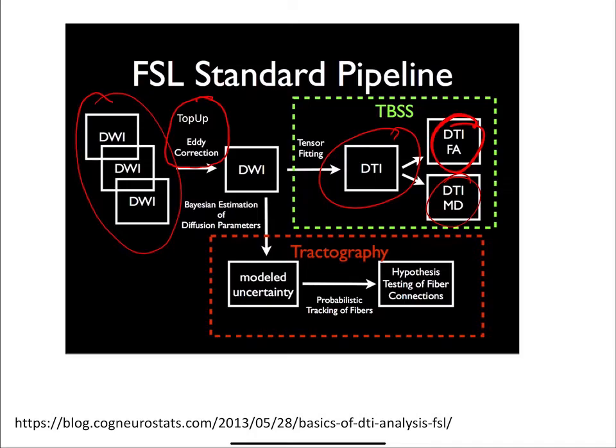Time, right? This is really fast. The other approach can sometimes take hours and hours of processing. If you have a GPU, it's much faster, but if you're trying to do it on your laptop, it might take a long time. So the upper path is still good to do because it allows you to see whether your data are reasonable. If you run it through this very quick algorithm and you end up with just noise, then something's wrong with my acquisition.